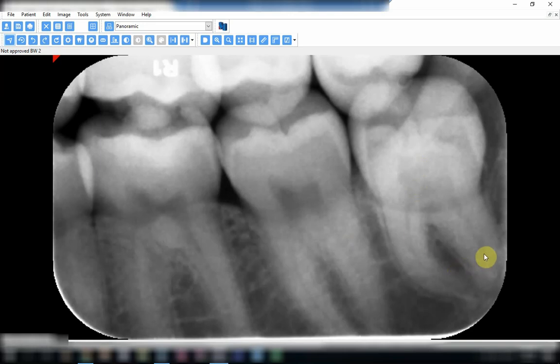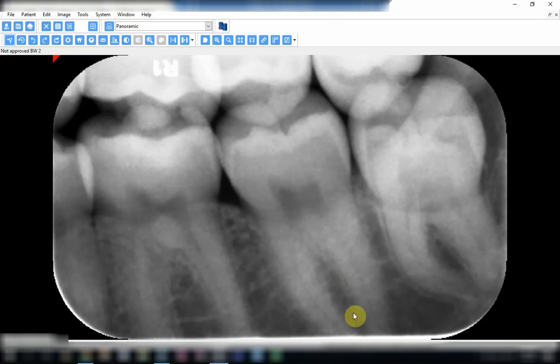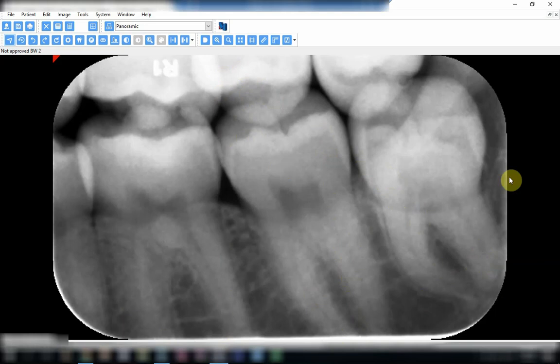Looking at another radiograph of the same patient, the horizontal angulation is almost okay here. But the placement of the film was incorrect. This happens in bitewing radiographs when the film is pushed too much downwards, so it becomes a mixture — a periapical which is not correct because the periapical area is not showing, and at the same time it's a bitewing but not showing both upper and lower teeth properly.